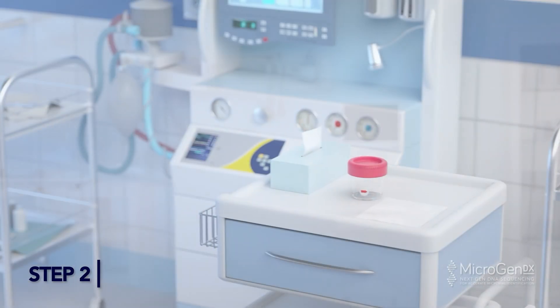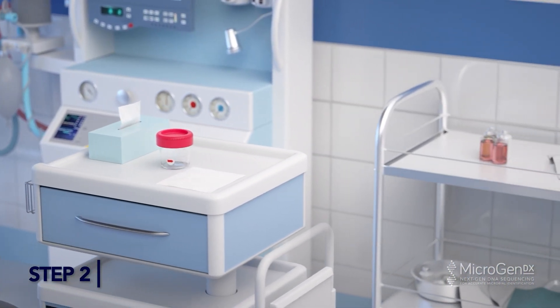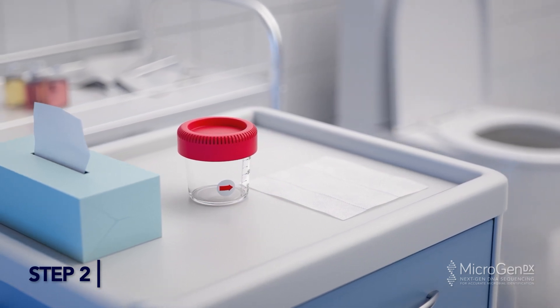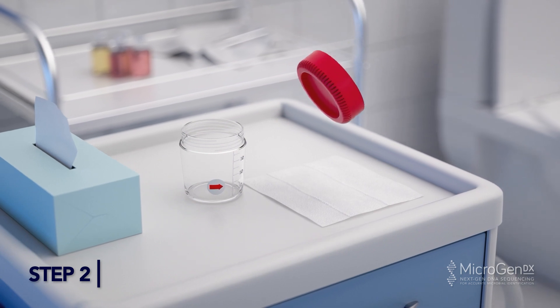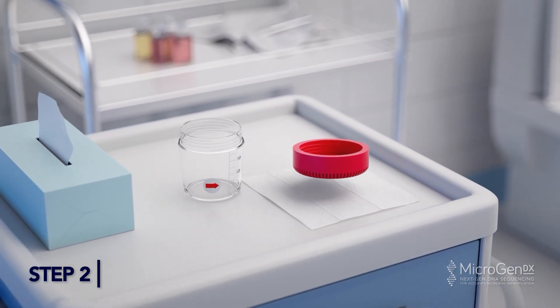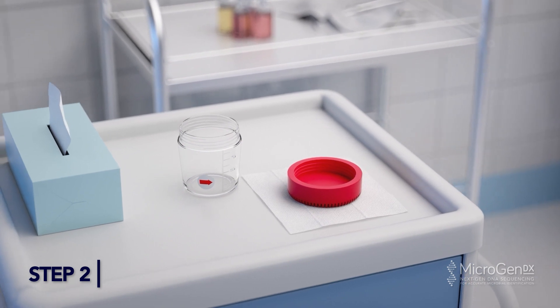Step 2: Spread a clean tissue on a surface close to the toilet bowl. Remove the lid from the urine cup and place it topside down on the tissue. Place the open urine cup next to the tissue, being careful not to touch the rim of the cup or lid with fingers or body surface at any time.